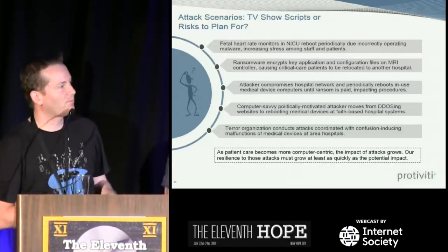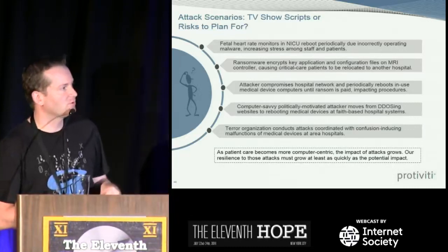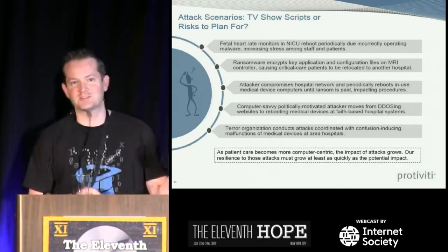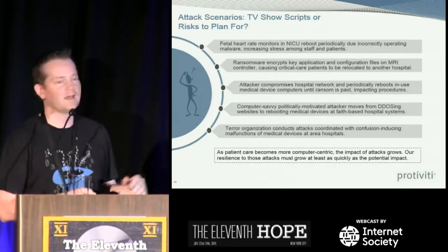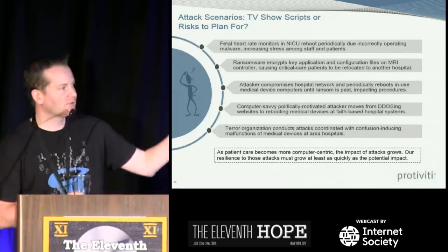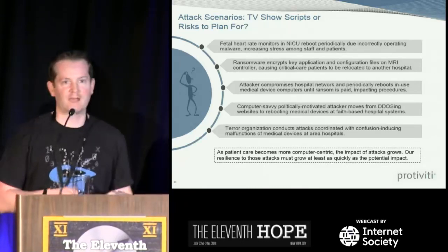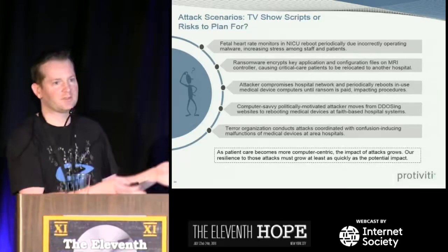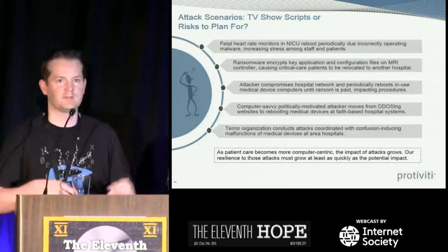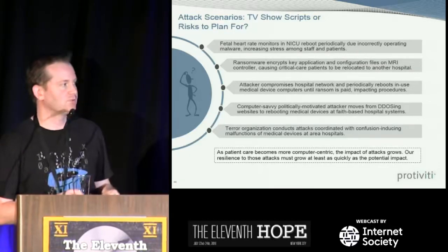An attacker compromises a hospital network and periodically reboots medical device computers until a ransom is paid. TV, right? These ones start getting into TV territory. I don't know of any examples of this happening. And you can go down to scenarios involving terrorism, where you have a coordinated attack between a kinetic attack and messing with the hospital's medical devices at the same time, causing confusion. These are all wargaming type things, and they potentially make for good TV shows.